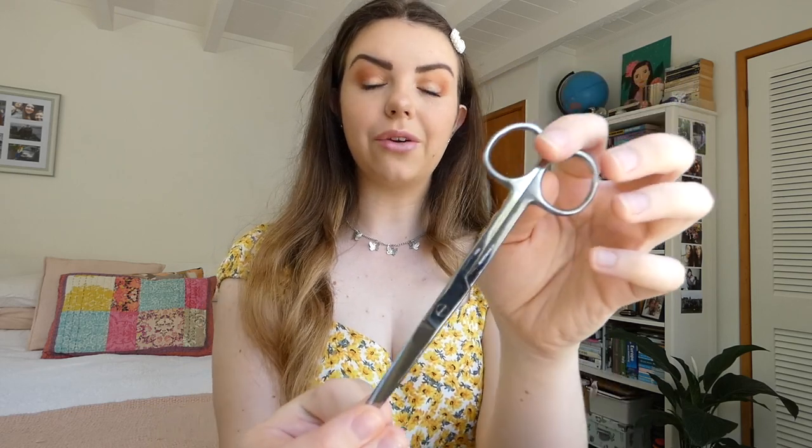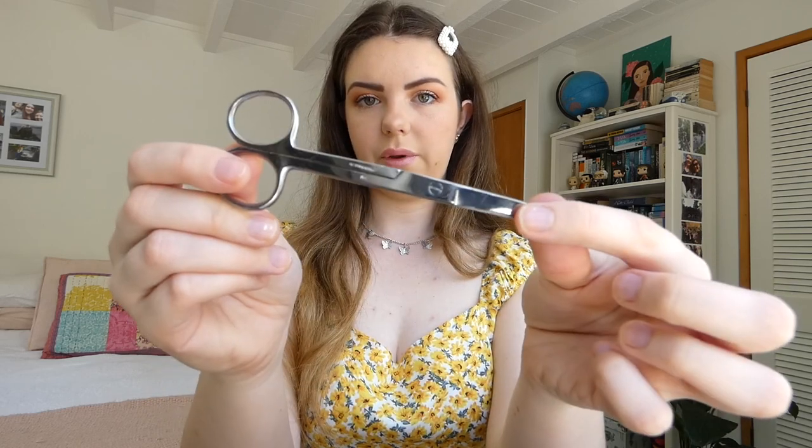I've also got this pair of scissors. This was another thing that we got in our little blue bag at labs, part of our equipment list. Very handy for bandages.